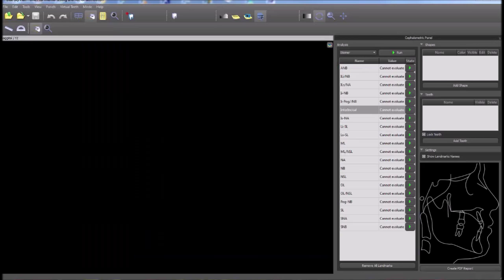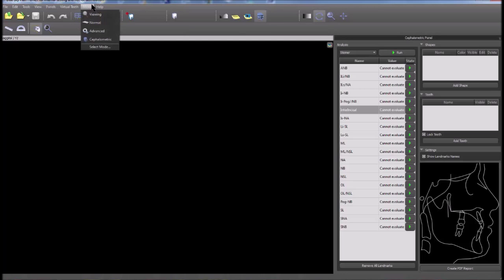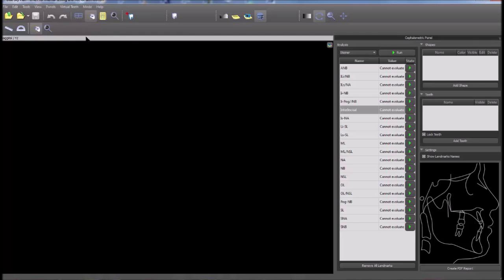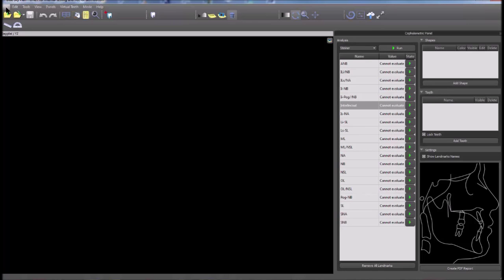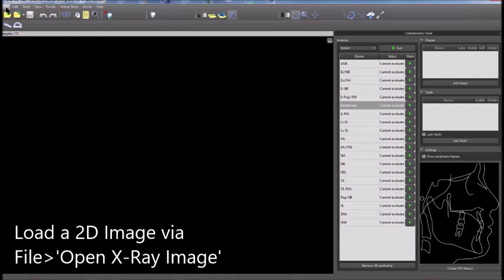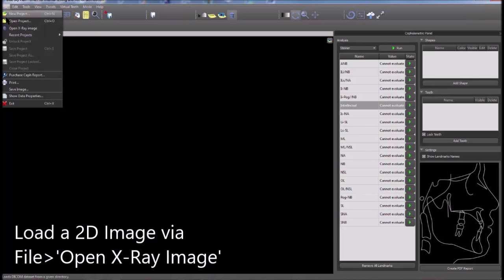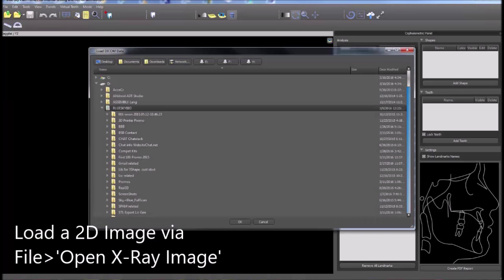In order to start cephalometric analyses, go to the mode menu and click on the cephalometric choice. Then go to the file menu and click on new project to open the DICOMs.